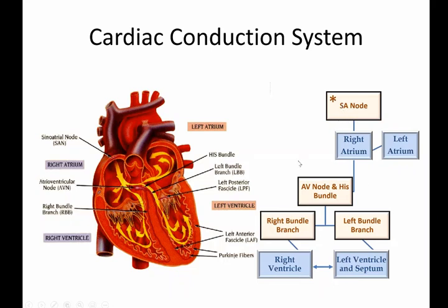You can notice here that there is only one pacemaker which controls the activation of both the upper atria as well as the ventricles. This is what normally happens, and we call it AV association, because there is only one pacemaker controlling both atria and the ventricles.